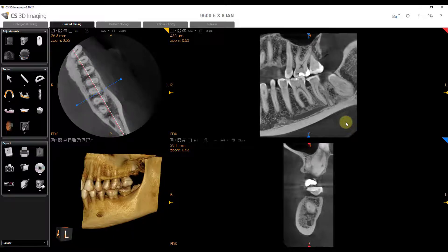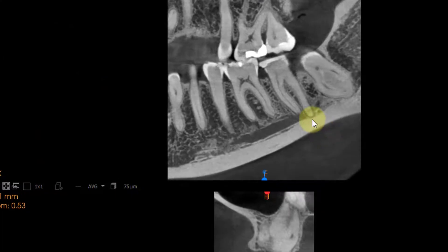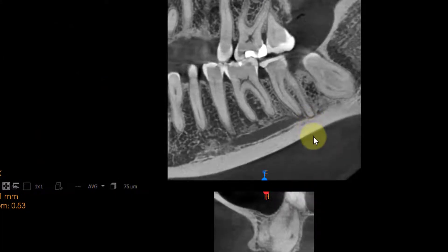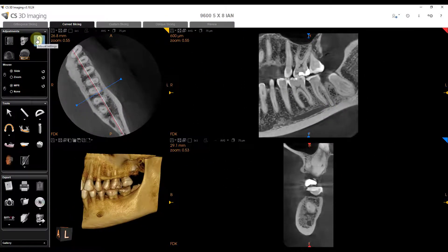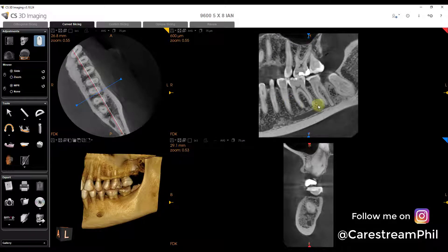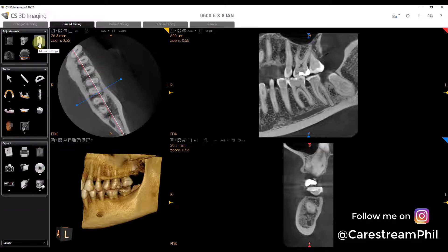Hey, what's going on? So this is a super useful tip for anyone using the CS3D imaging software. When I'm going through a case, I'm constantly going back and forth between slicing or sliding through the scan and zooming in and out of the scan. And often, if you're not familiar with this one feature, you would have to open this up and then you're going back and forth between zoom and slide, and it just takes too long.